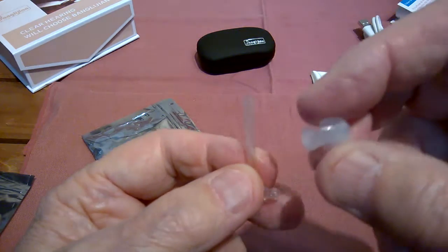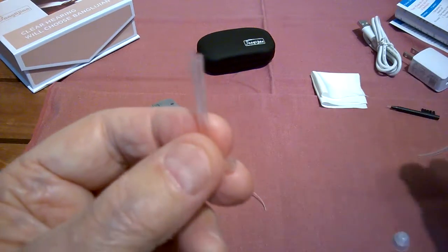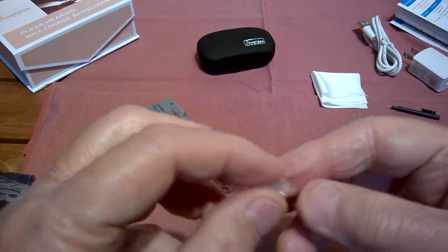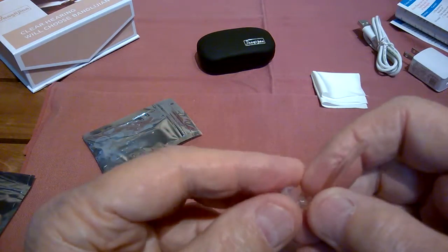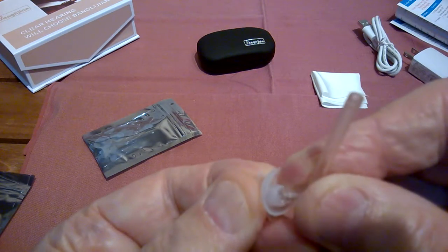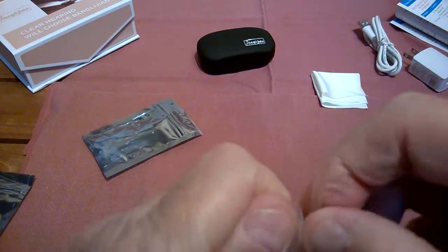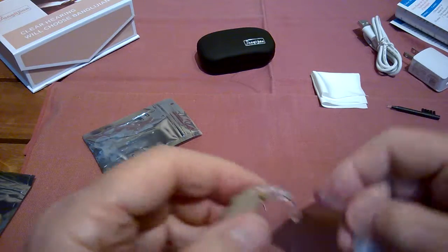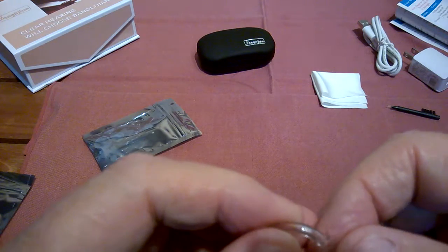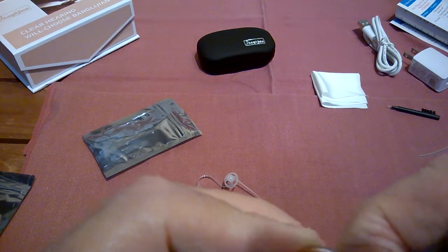And this has an assortment of regular round domes that fit on the bottom. And again, a double dome, which is like an open design. So this will let air into your ear. And this just goes on, shoves right in. Nothing to screw, it just will push in. And then this will fit on the little piece I showed you to begin with. And it just slips over that. No threads, it just slips over.